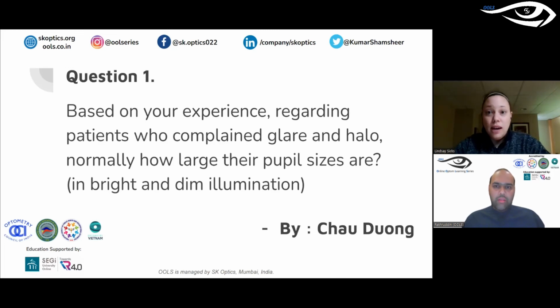One thing to think about might be, if you have a certain lab that you're going to work with and a certain design that you're going to lean on, asking the laboratory if they have a suggestion. I say that because they may be more familiar with working with the files from a certain topographer, or it may give them information that they can use.